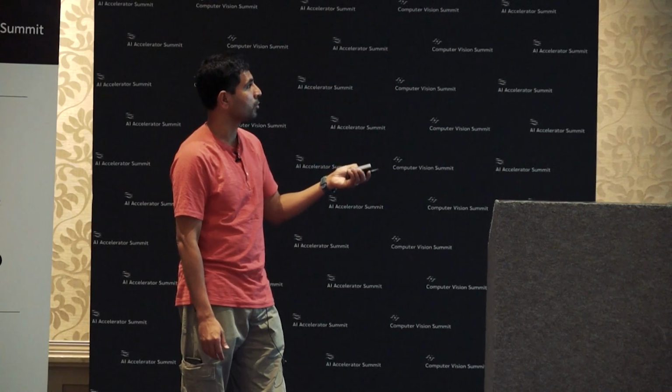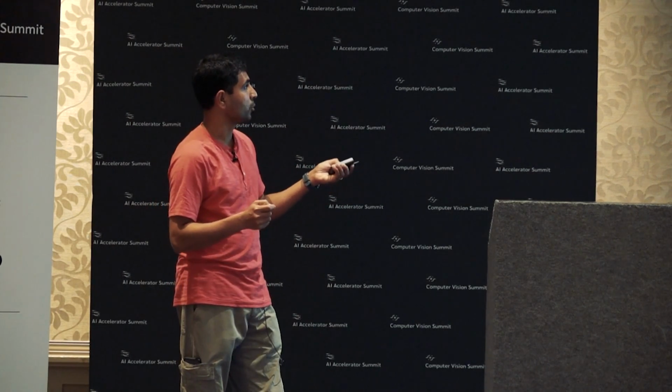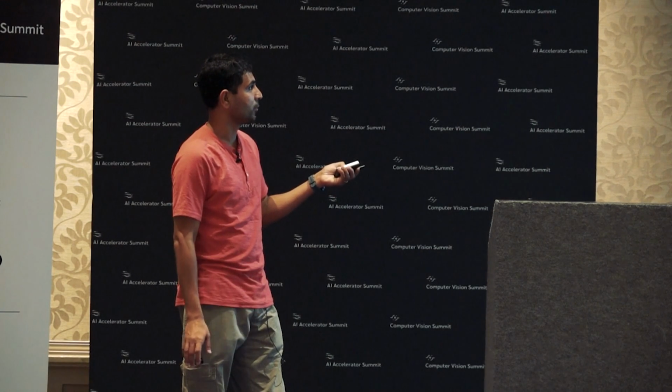And they actually have, I'm jumping ahead a slide here, a scoring scheme. Ideally, you can get up to 6 points if you did the surgery right. So if you are able to see the two structures connected to the gallbladder, and the two structures are clearly seen, you get 2 points. I won't go into the medical jargon, but if you get a clearance, and the bottom 1/3 of the gallbladder is clearly seen, you get 2 points. So you can go anywhere from 0 to 6 points, and based on what the video is actually showing, the surgeon can score this resident's performance and help them take the next step. So this is post-op analysis, where the surgeon is watching the video and evaluating the resident, right?